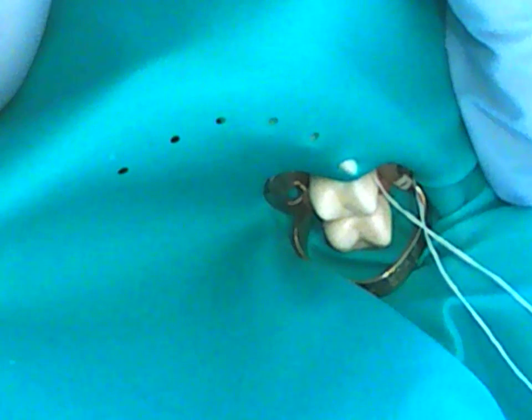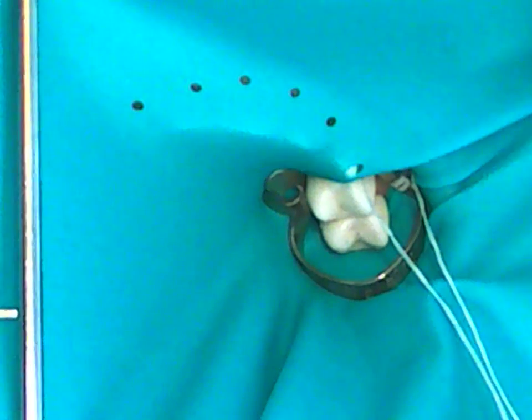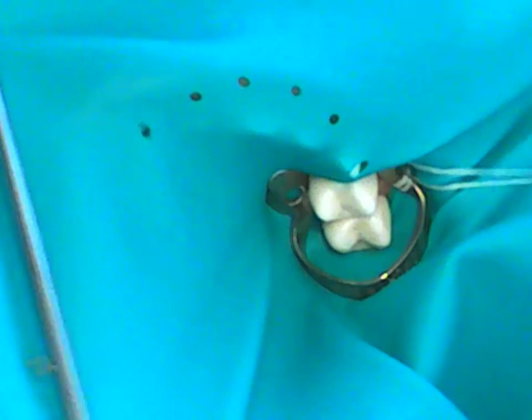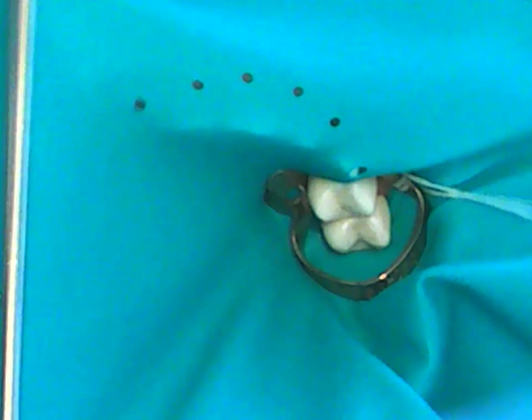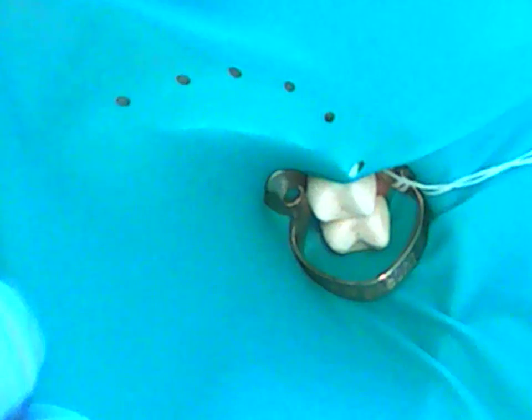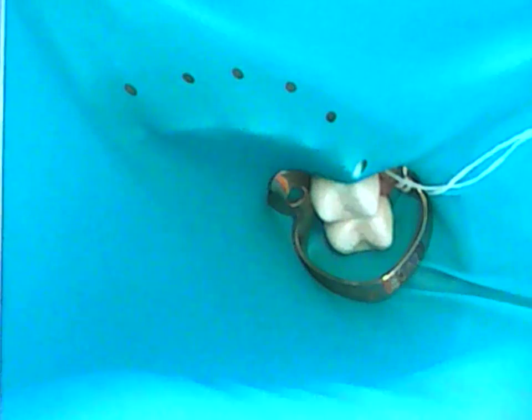It's at this point where I like to put the frame on. It's over the bow and most of the jaws, so get your four corners of the frame attached to your dental dam. If I just back this up a bit, you might be able to see that. Okay, I'm going to wrap the floss around the frame. Sorry you can't see that part in this video, but if you refer to the other videos of the maxillary posterior area and mandibular posterior area, you will be able to see that.